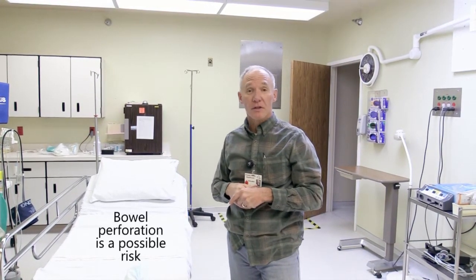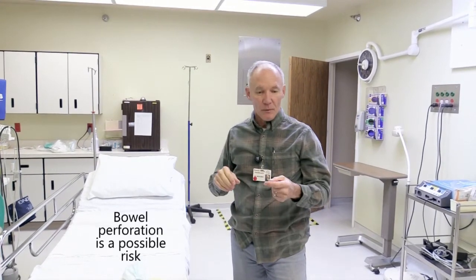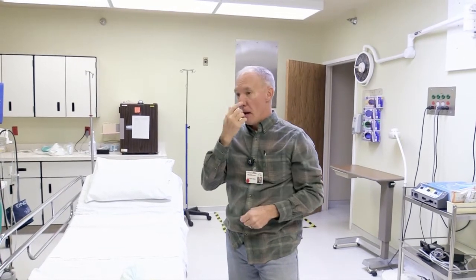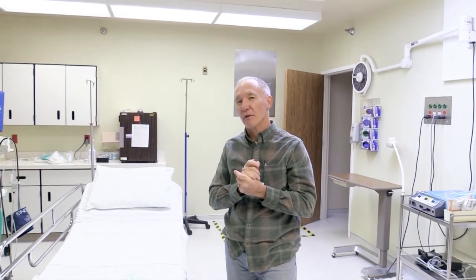And then another one is perforation. So that's the one that everybody worries about. So that's popping a hole in your colon. So like I said before, without any stool in it, your colon's like a flat balloon, and you have to blow it up in order to see around in there. And so if there's a weakness in the bowel wall, the air that you put in there could pop a hole in your colon. Or if you're biopsying something or burning something, cauterizing something, then it could burn a hole through your colon. And so, knock on wood, I've still never had a perforation in the 25 years, but across the country, a perforation will happen 1 out of every 2,000 times.